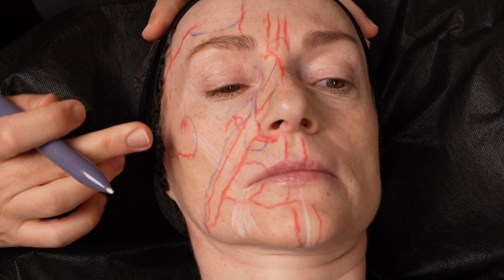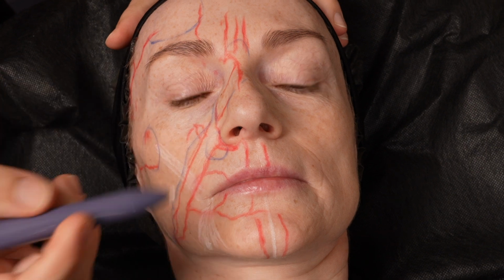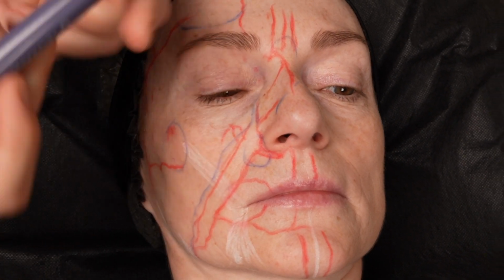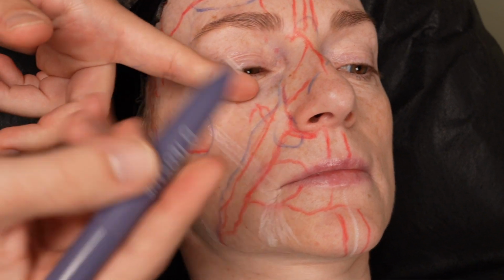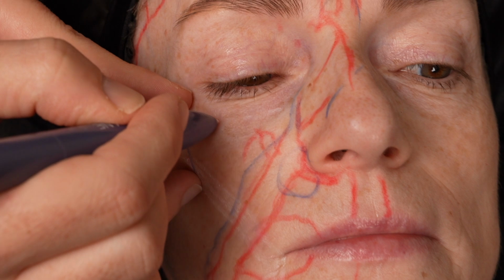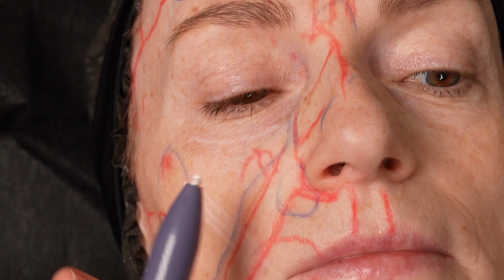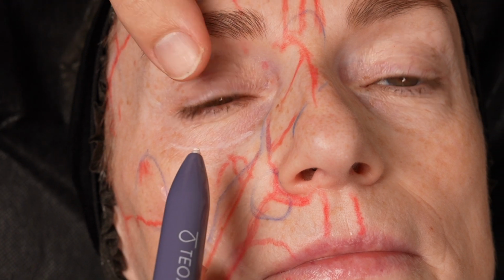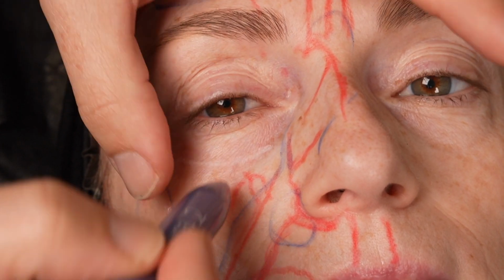You can inject, for example, but be careful where the infraorbital bundle is, because it also comes with the vein and nerves. Here is the orbital rim. Here is the mid-pupillary line, for example. Yes, here is the mid-pupillary line.